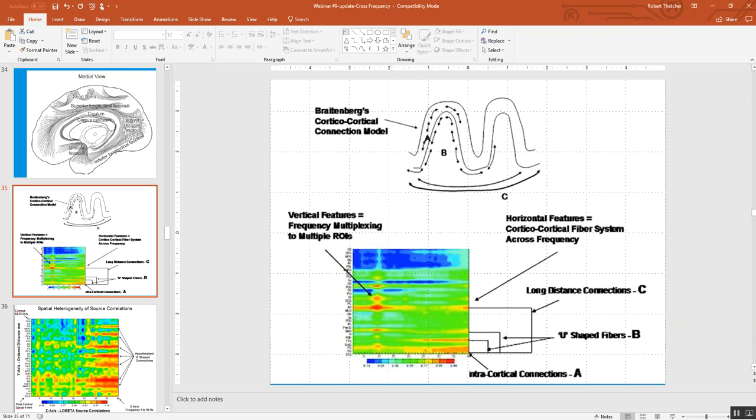Blue means it's quite low because the magnitude of the connections, the density of connections, decreases as a function of distance. But you can also see that here's the alpha frequency band, that these areas like the inferior temporal gyrus are communicating with other regions of the brain in the alpha band or in the gamma band or the beta band. So there's different frequencies of communication for each of these hubs.